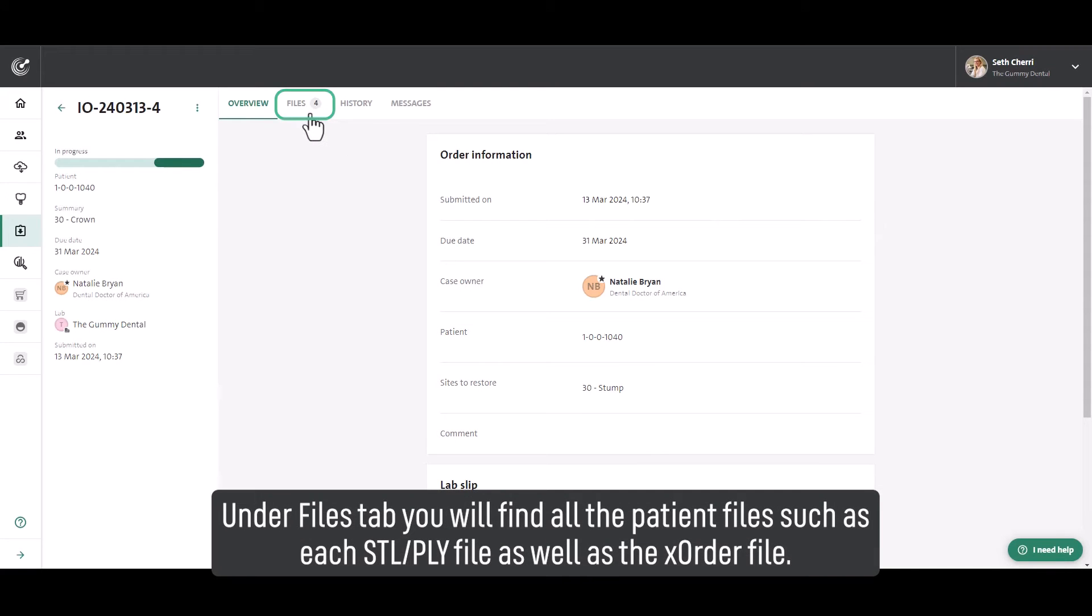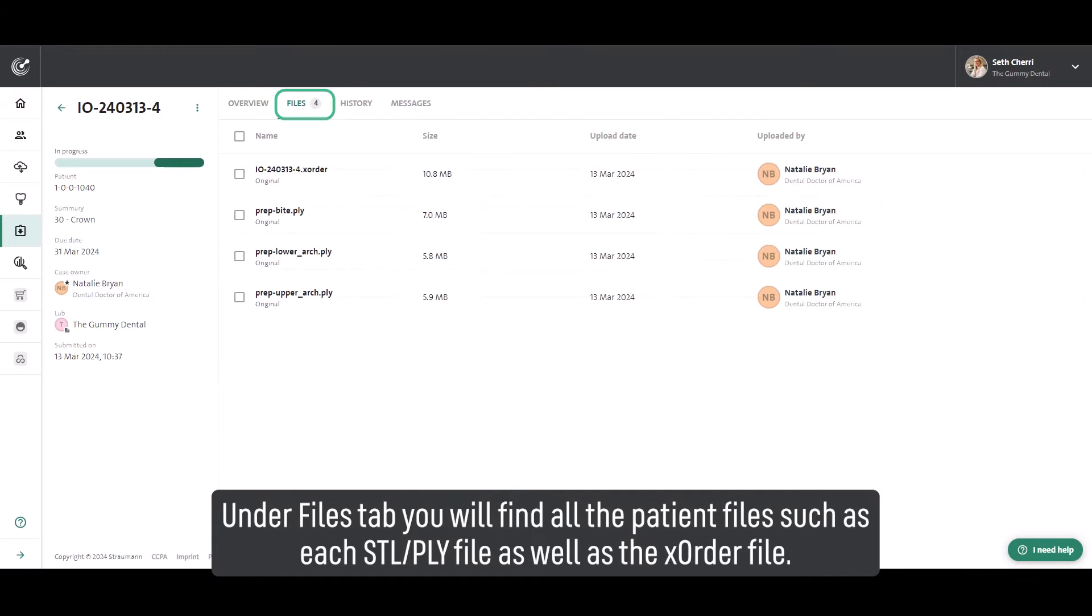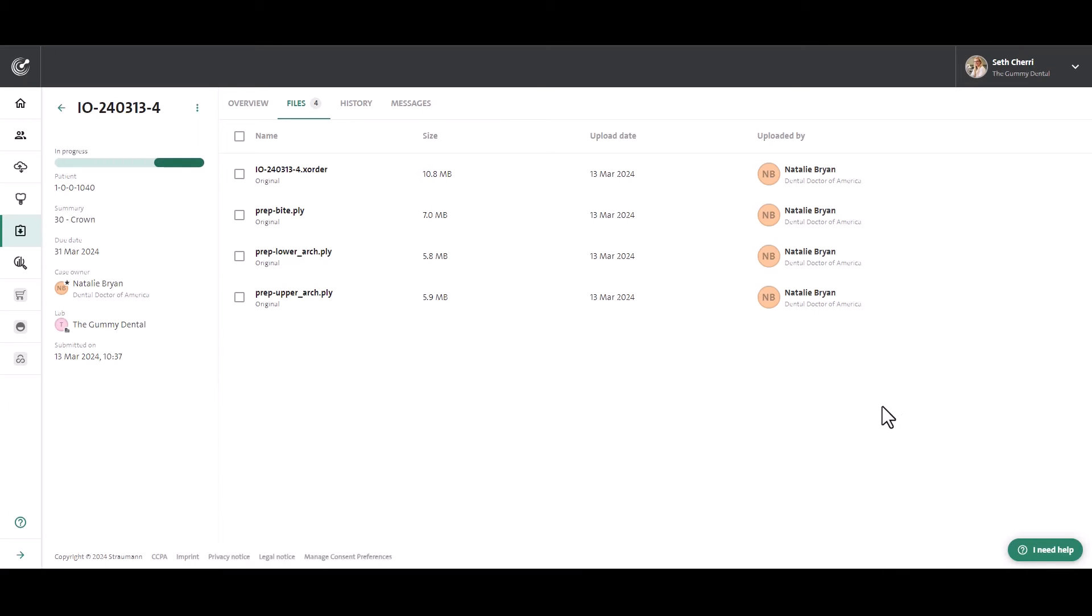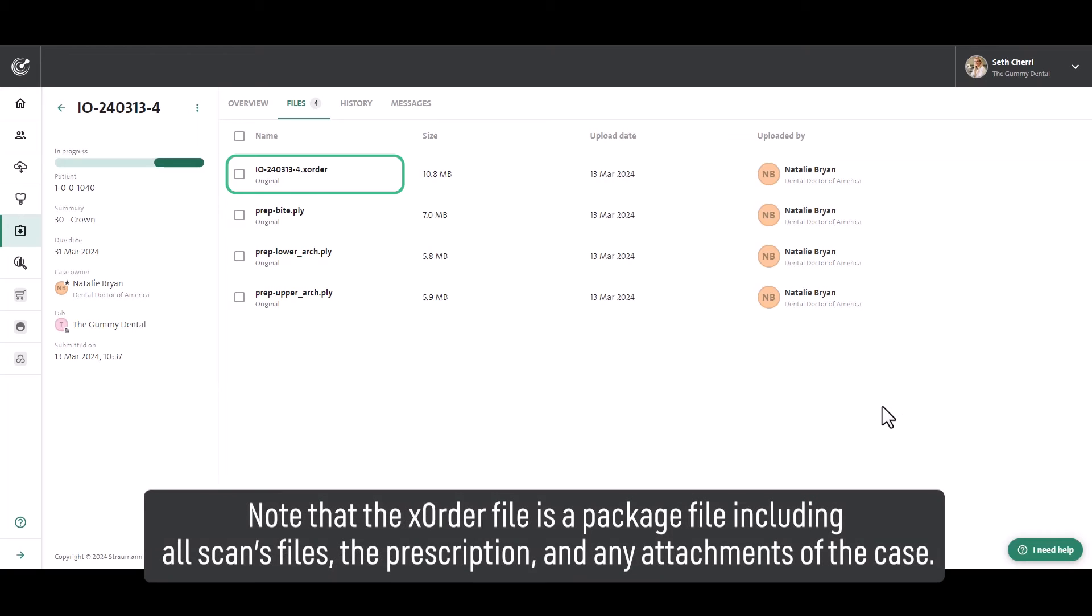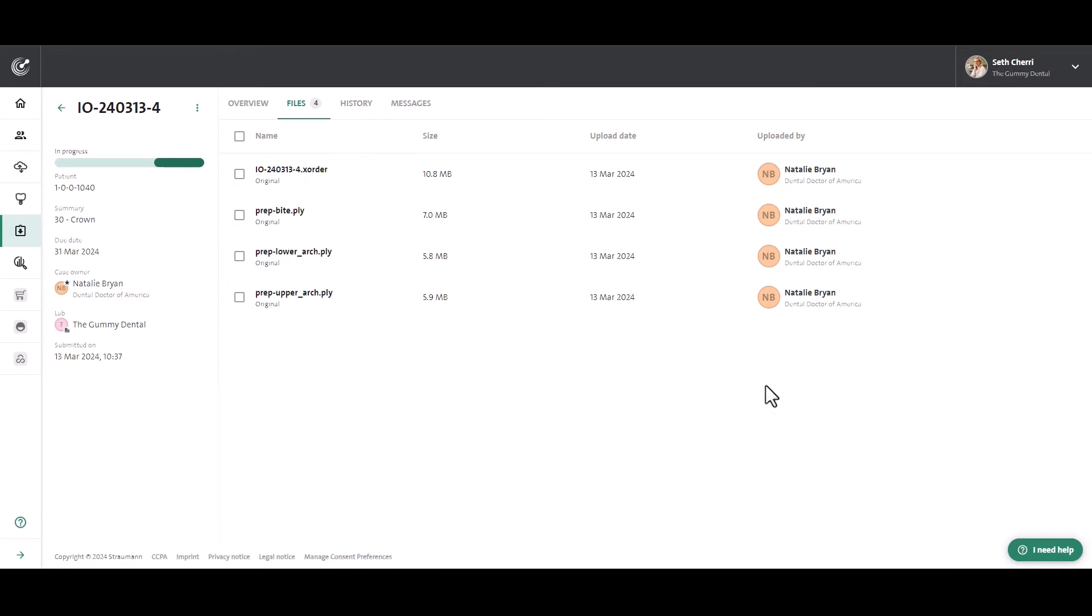Under Files tab, you will find all the patient files such as each STL PLY file as well as the XOrder file. Note that the XOrder file is a package file including all scan files, the prescription and any attachments of the case.